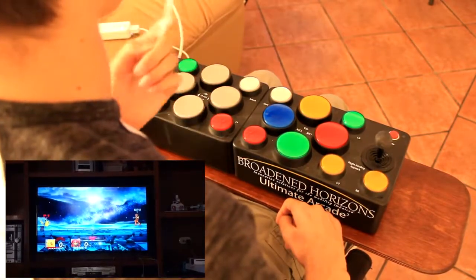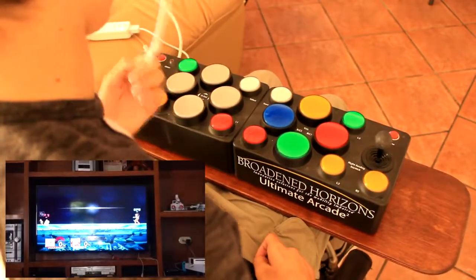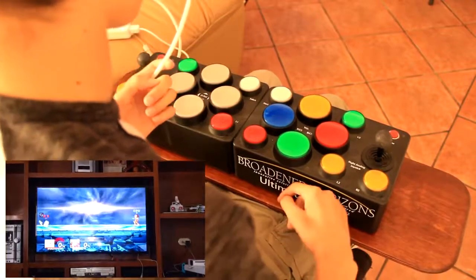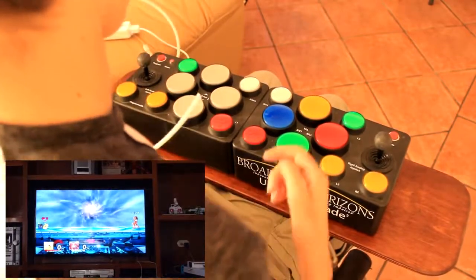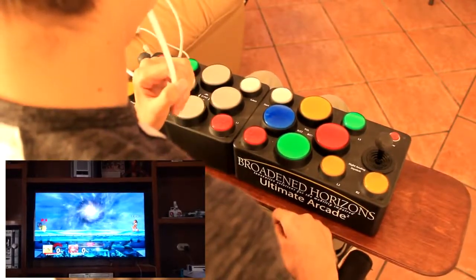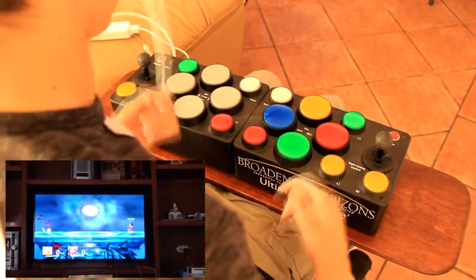Right now I'm going to try to make the sip function be jump, which would be the Y button. And maybe I'll try blowing — puffing — as R1. It's exactly the same procedure for remapping. So I press program, and I want the jump function, so I press Y, and then I puff. That programmed it, and now if I blow here, it's going to jump. And that's how it works.